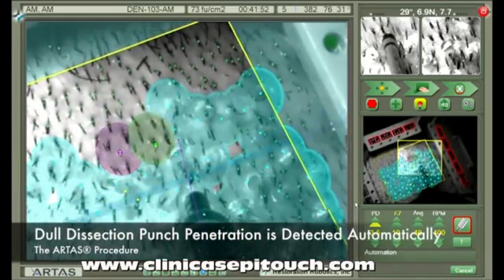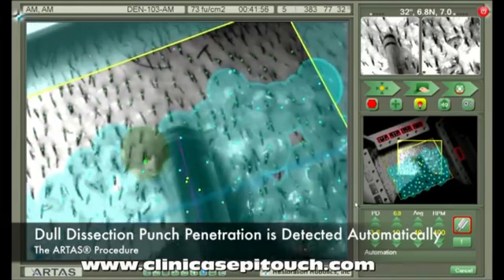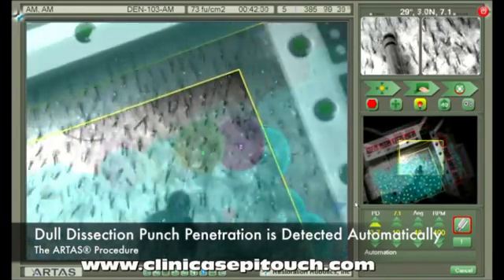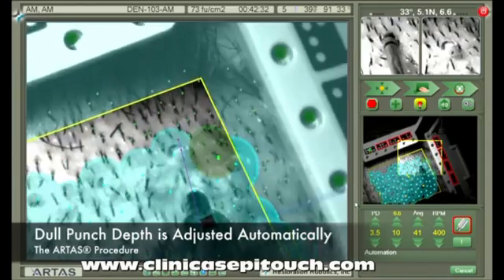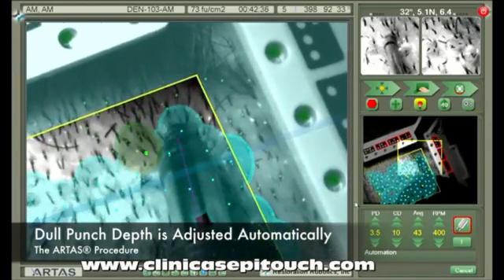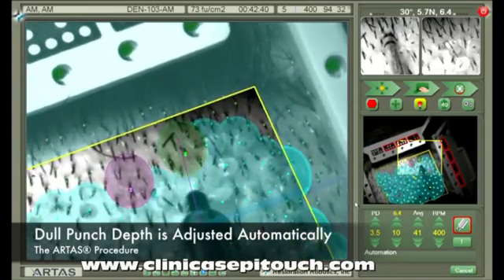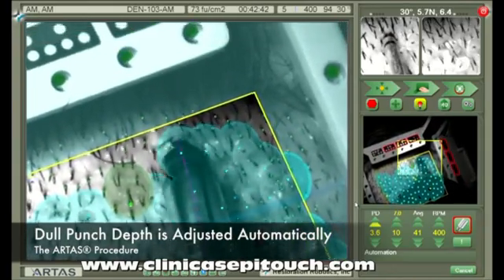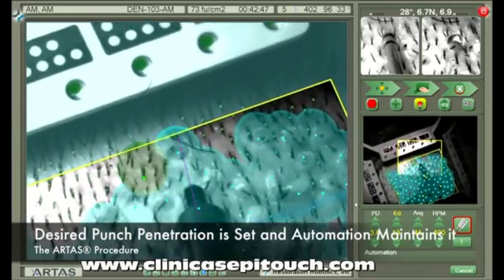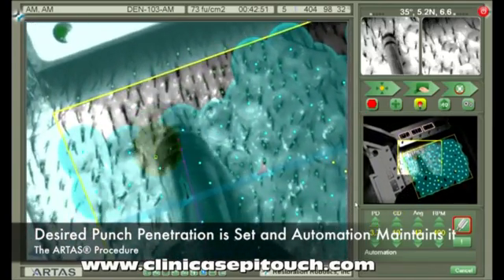Next, let's look at the CD parameter. CD stands for coring depth. This is the depth of the dull dissection punch that enters the skin after the sharp needle enters it first. The point at which the punch enters the skin fully is detected automatically by the system. The user simply sets the desired penetration, and the automation system maintains it.